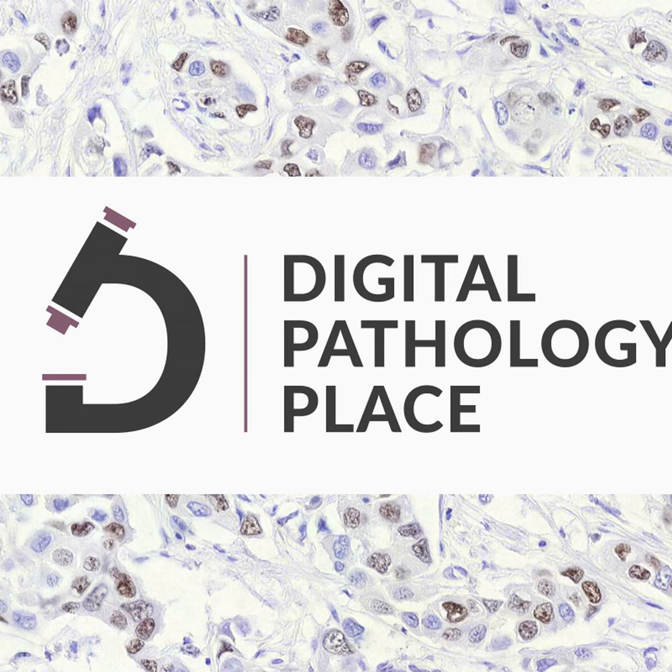Yeah, so I think this is a bit too small scale to draw definite conclusions. What we see is a bit of a confirmation. If you look at Gleason grading in prostate cancer, we know that, for example, cribriform growth is now classified as a pattern 4, where historically it could be both 3 or 4.